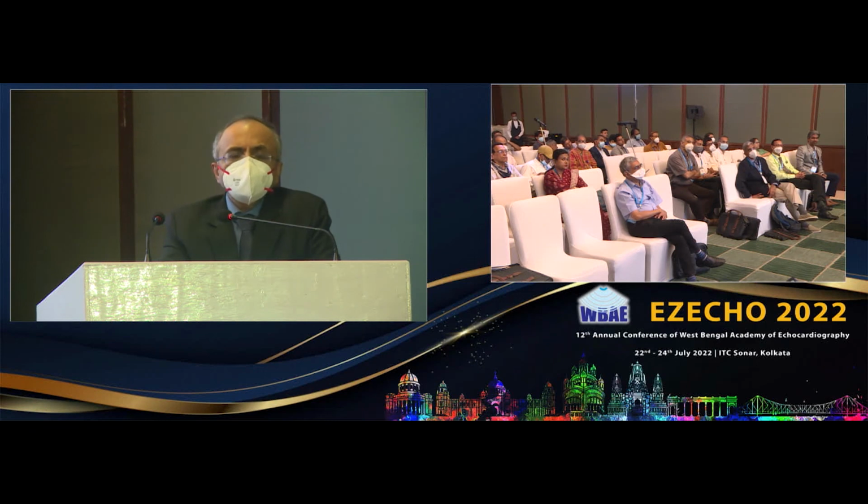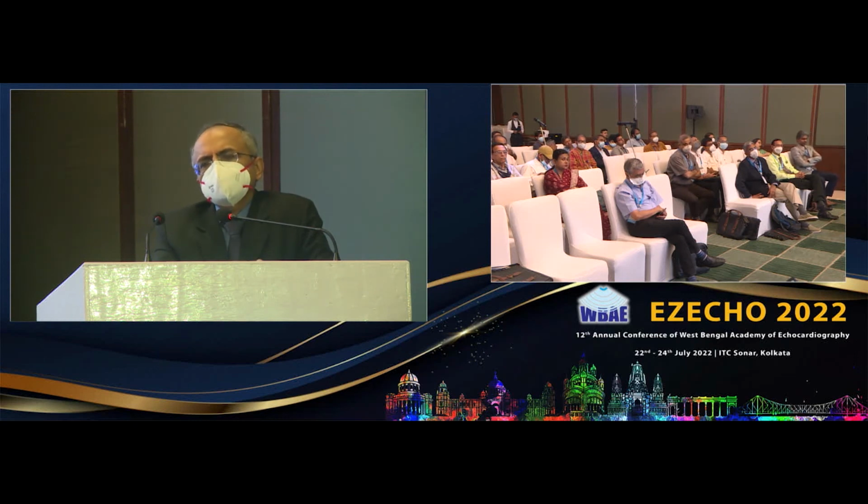And secondly, the T1 values. Generally, the athletes will have very minimal T1 rise, just because the myocytes are hypertrophied and they have much larger sarcomeres. But their T1 values will not go like HCM, going into that 1300 range. So that is one thing.